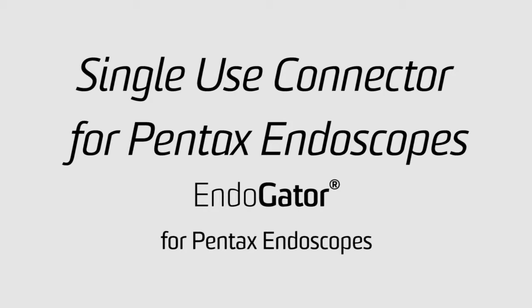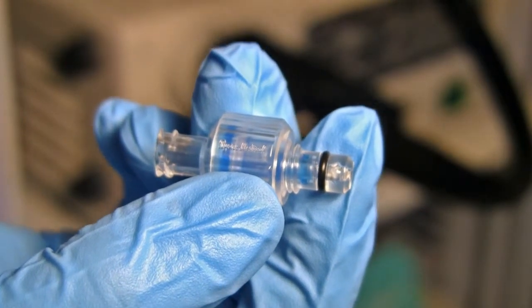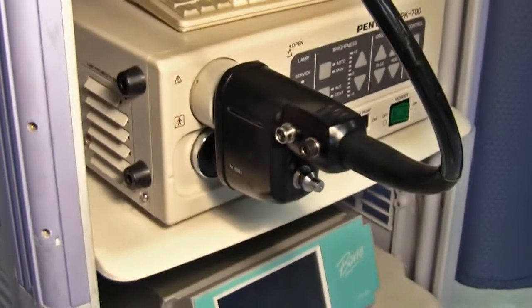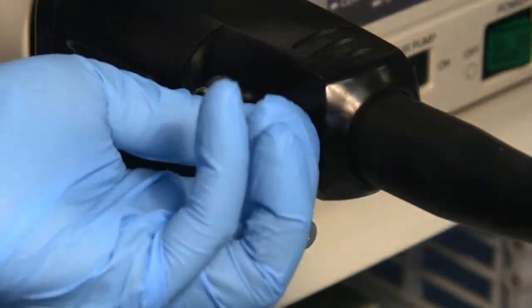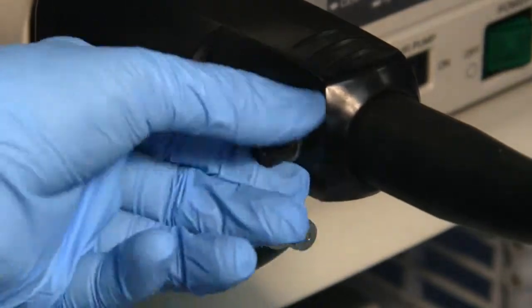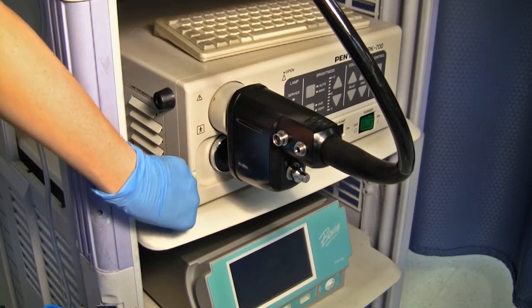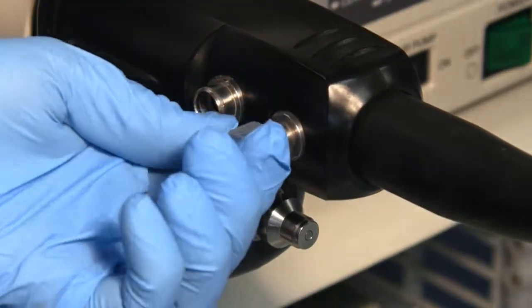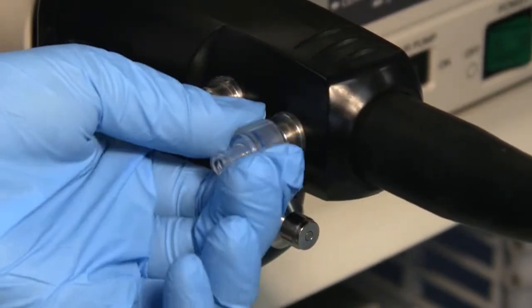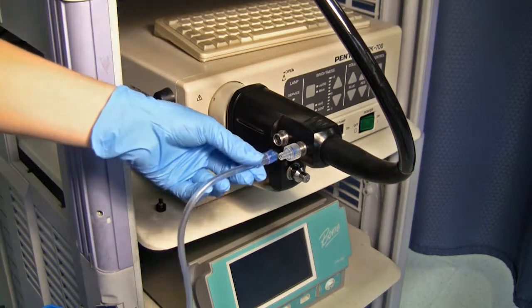Being a truly universal solution, all endogators can be used with any scope on the market today. Here we have a Pentax scope and connector shown. With the Pentax scope, to use our single-use connector, you must first remove the black water jet channel adapter. After you have done so, take the single-use connector and thread it onto the scope in a clockwise fashion. Then luer lock the endogator tubing to the single-use Pentax connector.